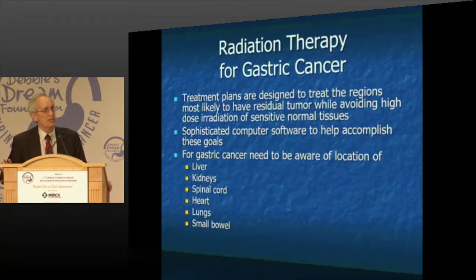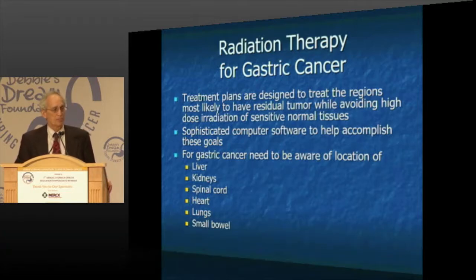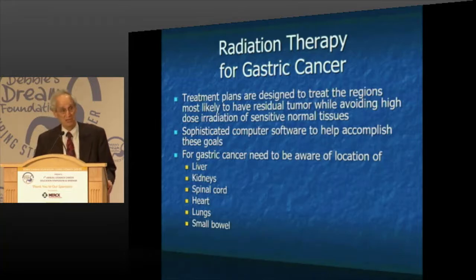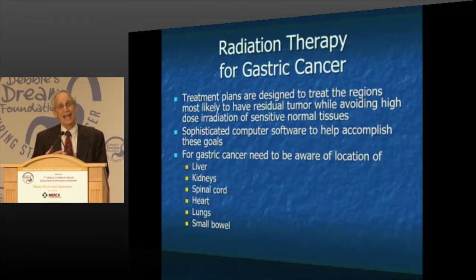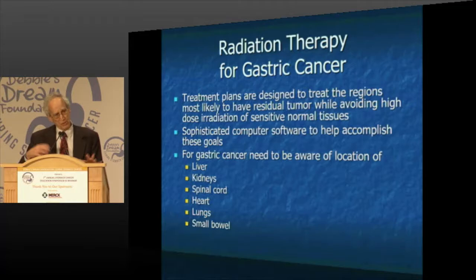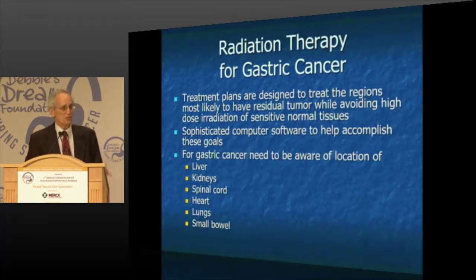And it is critical that we minimize the radiation dose to the sensitive tissues of the body. For stomach cancer, we need to worry about things such as the liver, the kidneys, the spinal cord. For tumors that are higher up, the heart, the lung, the small bowel, and all of these can be damaged from the radiation, and we try very hard to avoid that. And so we go through a process. I'm going to go through some slides, and I wish the pointer worked. You see in the middle we've outlined areas that we wish to treat, and then things coming in from the side of that multi-leaf collimator that I showed before, conforming the shape of the field to what we wish to treat, and also to what we wish not to treat.